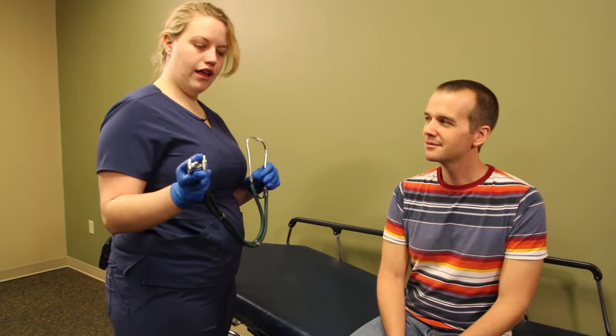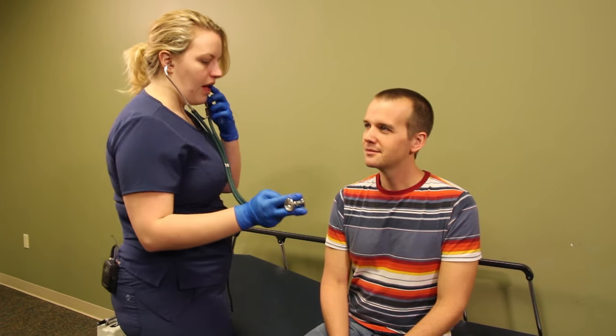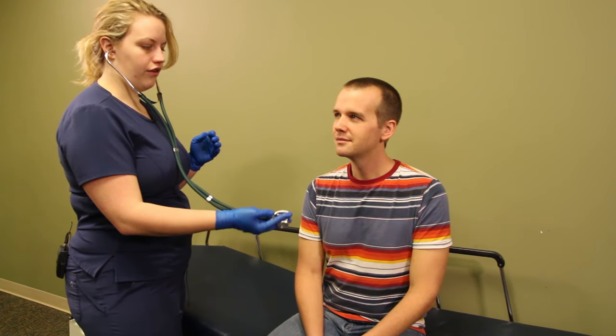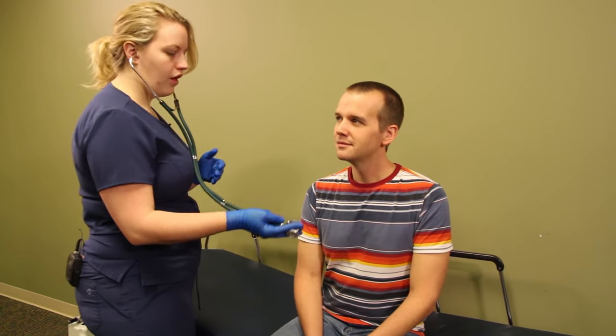For our patient, we are going to listen to heart and lung sounds. We are going to start with lung sounds. We are going to take our stethoscope and try to listen to the lobes of the lung to see if there is an issue with a specific lobe. We are going to listen in four places.